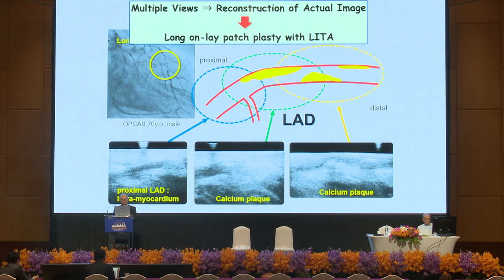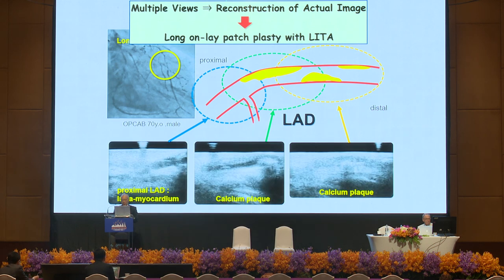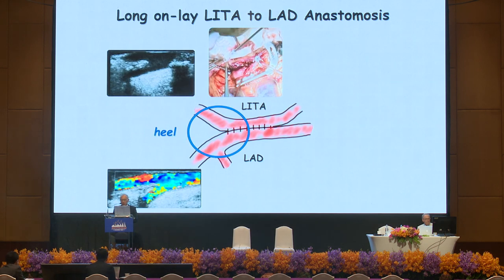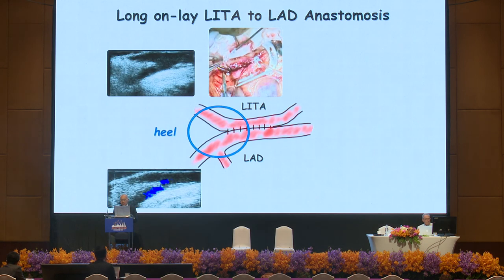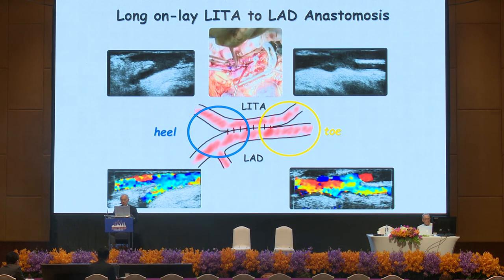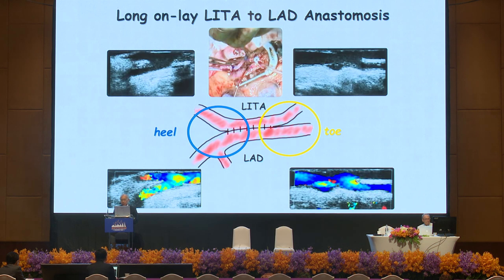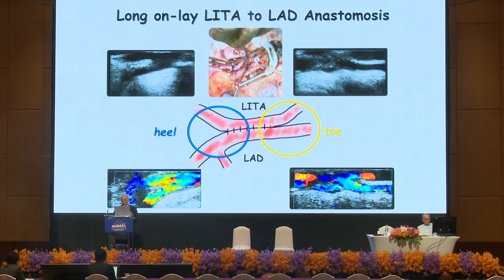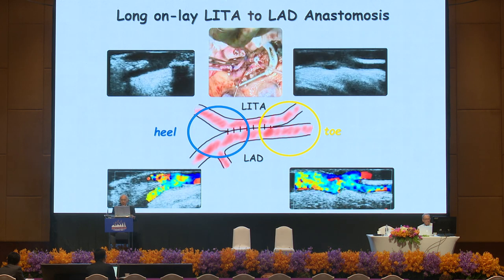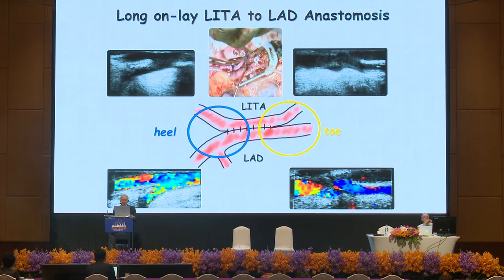Then finally I decided I have to make a little bit longer incision and do a patch plasty. After the procedure, I check it. The heel position is nicely opened, overriding the calcium portion, and the toe portion is nicely okay. So I can leave the operating theater with definite confidence of the patency of the graft.